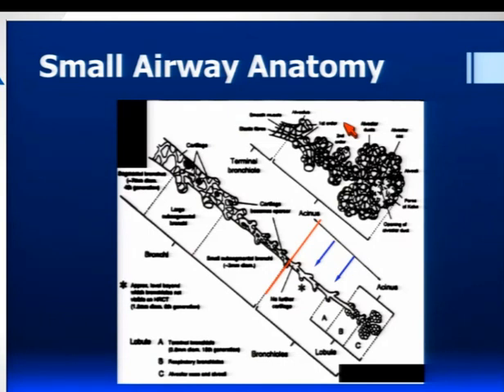The only way you're going to see signs of small airways disease is either whether there's a pathological process which renders those airways visible, or there are some indirect signs related to abnormalities in the airways. And we'll get to that when I talk about the small airways.